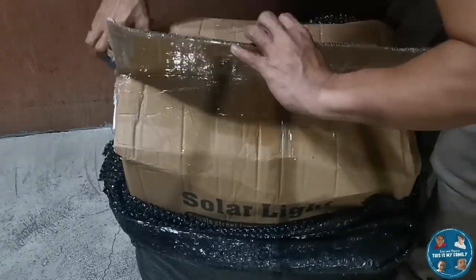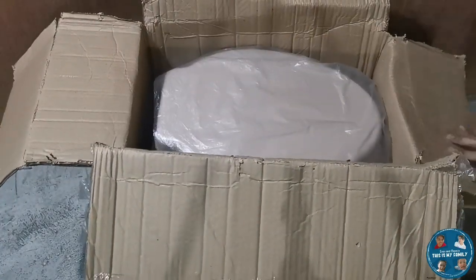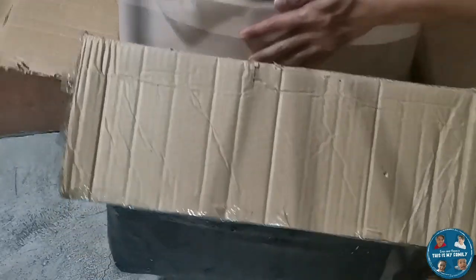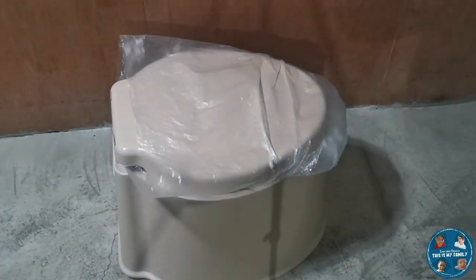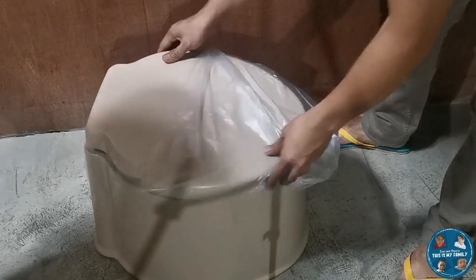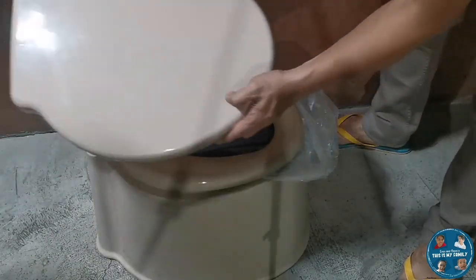Let us check out the inclusion of this item inside the box. As you can see, it is the lightweight version of a toilet bowl. I think it weighs around 10 kilos — it's very portable and light, I must say. So let us try to install it.